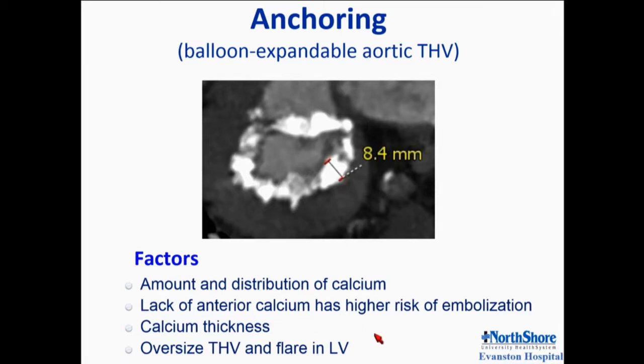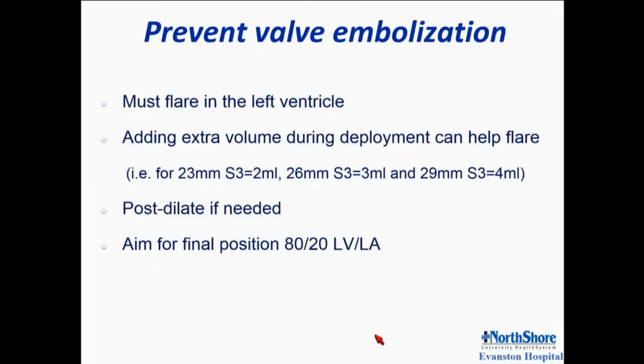And as I mentioned, we had to oversize and always flare in the left ventricle. Don't leave the cath lab unless you flare, or at least know deep in your heart that you tried everything you could to flare. If you cannot flare, then there's not much you can do. But add extra volume from the get-go, from the beginning.